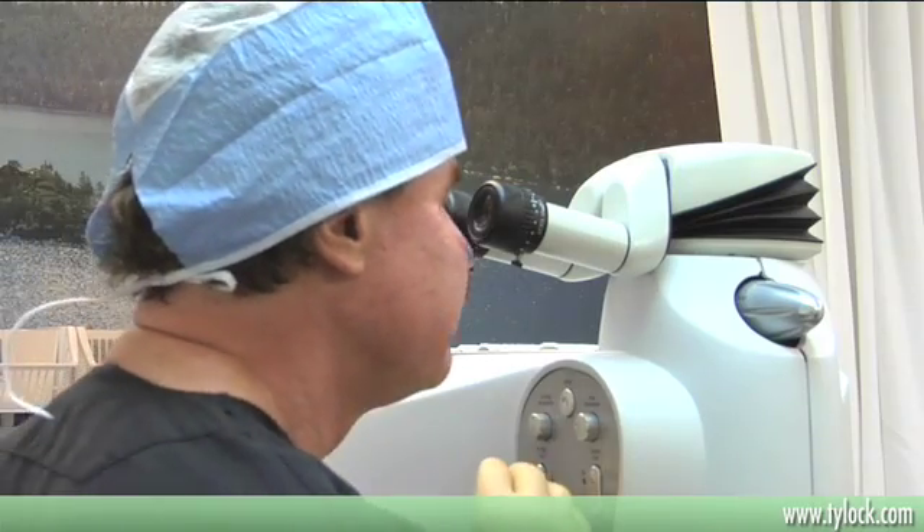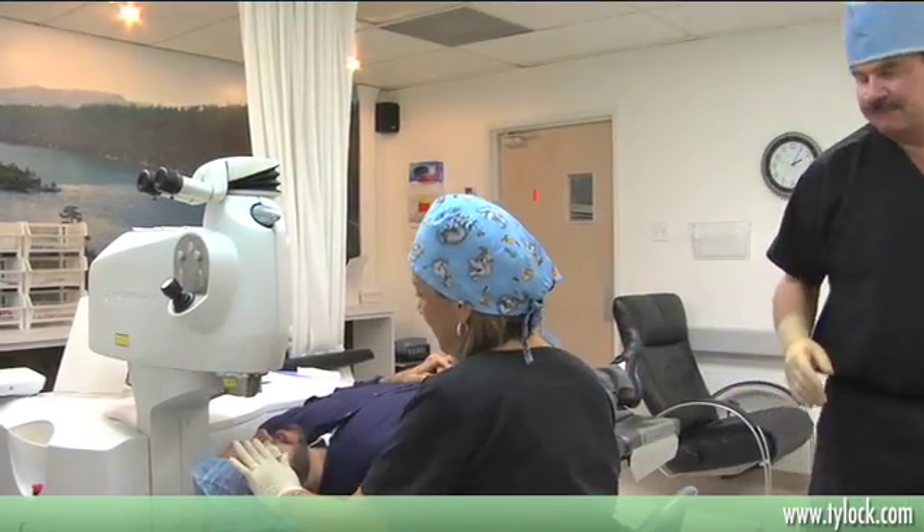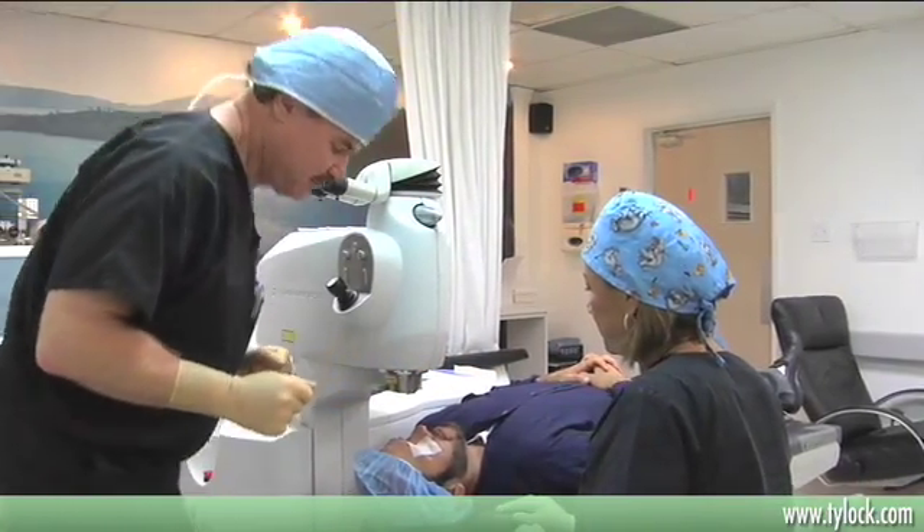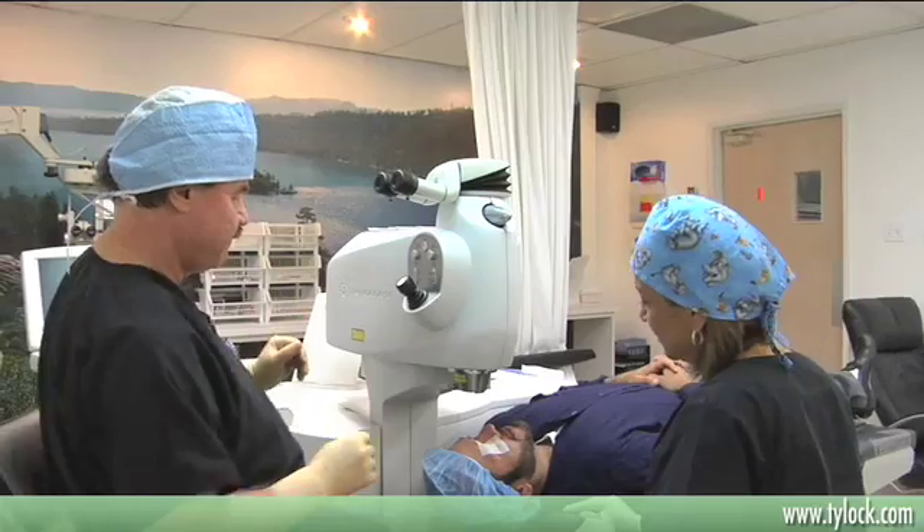And typically the flaps are thinner as well, so we're going less depth into the cornea. We leave more residual tissue that's untouched in the eye with the IntraLASIK procedure. The IntraLASIK procedure has become the standard of practice and the best practices in the country.